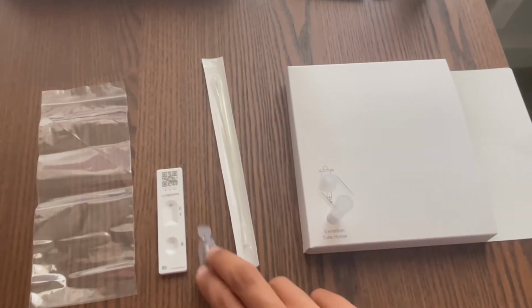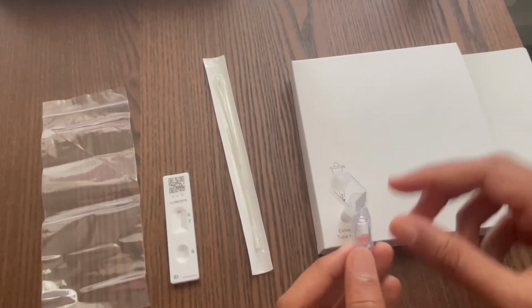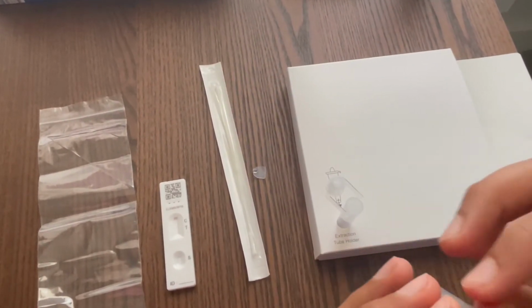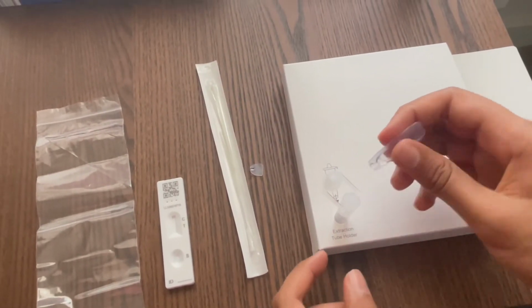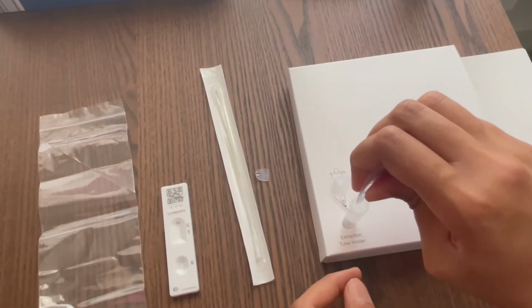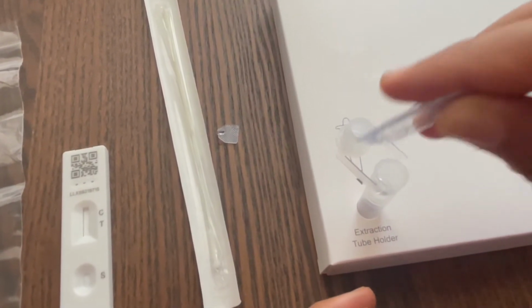Now we need to pour the liquid, there we go, into the extraction tube holder. Now let me just break this open. And while doing this, the liquid comes out of this hole right there, and try not to touch the inside of it. So just hover lightly off it and then pour the liquid in. It comes out like drops, and just squeeze all of it out into the extraction tube. There we go. That can go into this bag here.